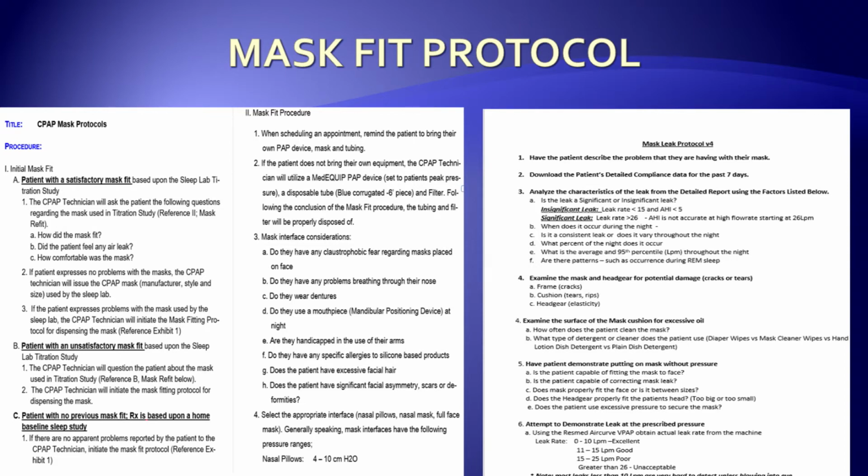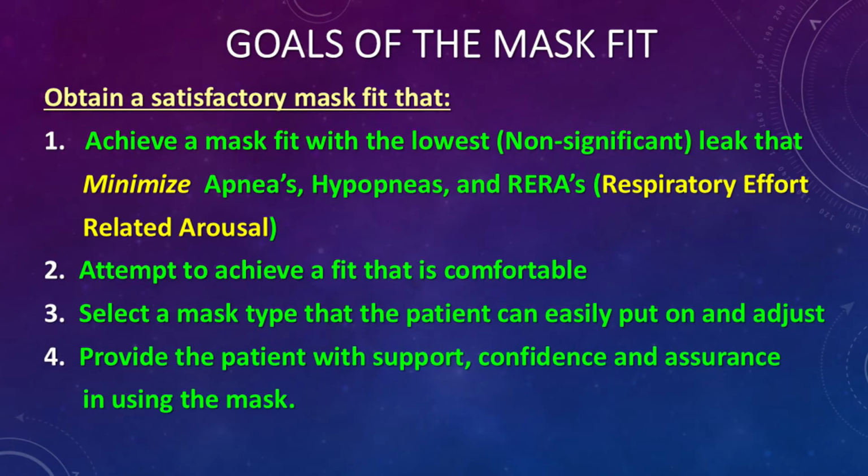But I think with regards to non-invasive ventilation, with regards to working with kids, with all of these specific situations, that you do need not only a policy or a procedure, but you really need a protocol that spells it out.